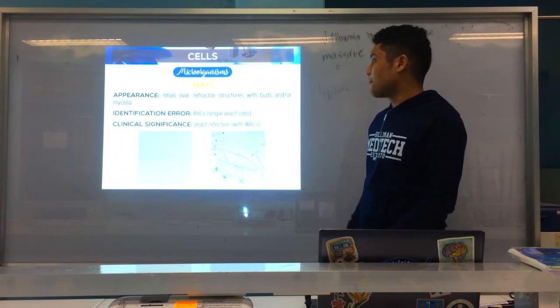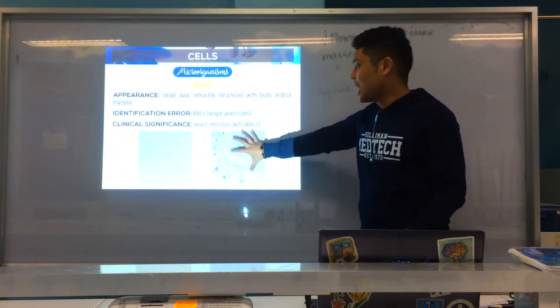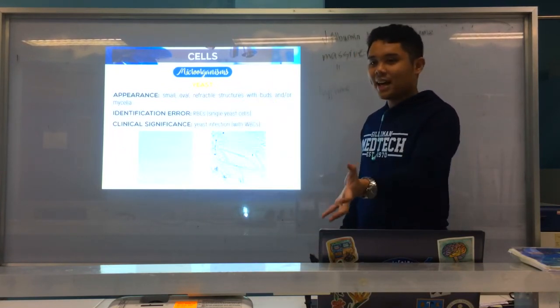Again, for yeast infection, na mycelia. So, usa kain ani is known as a hyphae or hypha. Pero if daghan na sila, mycelium or mycelia. Okay? Alright.